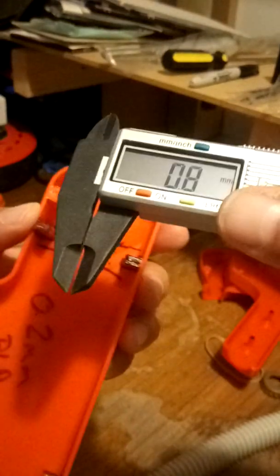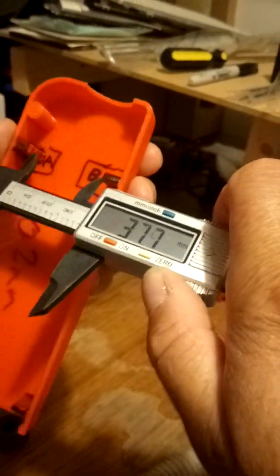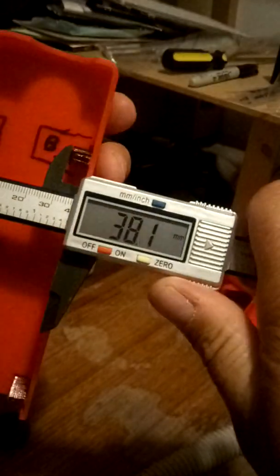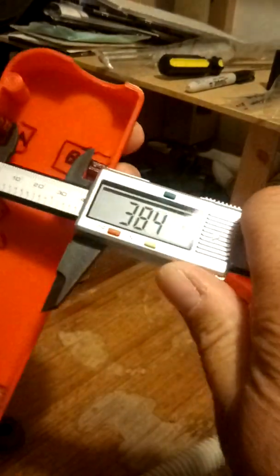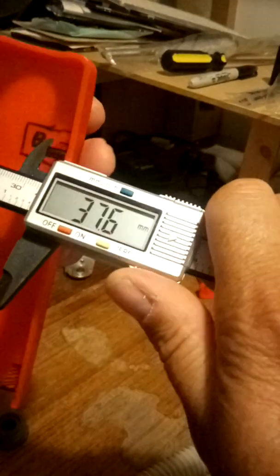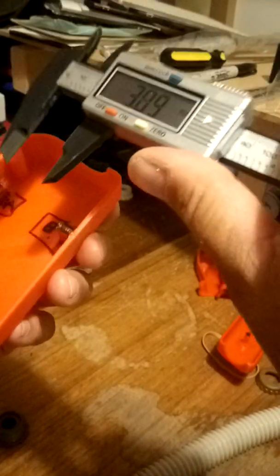I just need to measure between them a moment. Let's see if I can figure this out. Zero it, and the gap in there is about 38 millimeters, I'd say. At 38, I'm guessing. 38.4. If I do it about 10 times and then work an average out, 37. So I'm going to go for 38. Between A and B is about 38 millimeters.